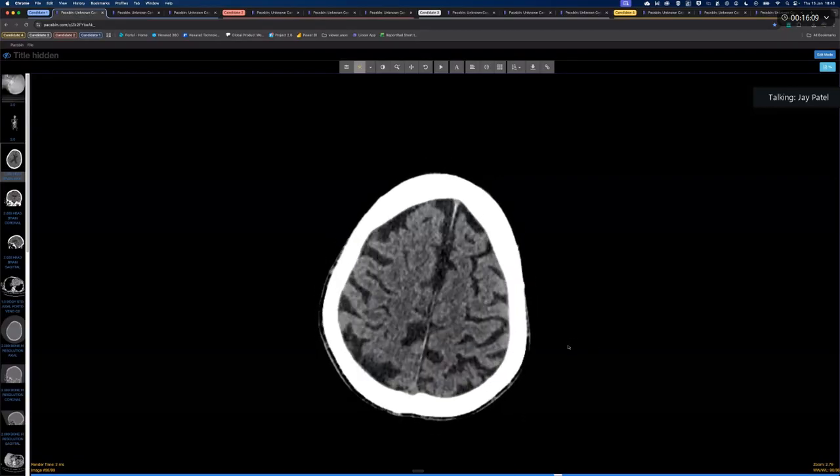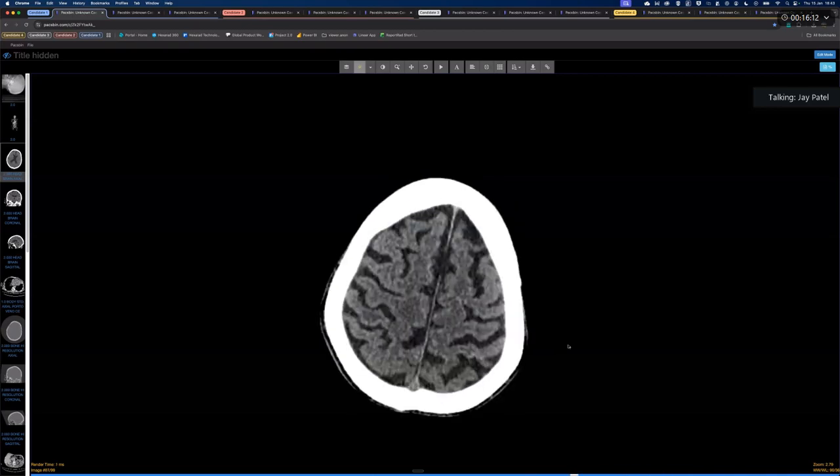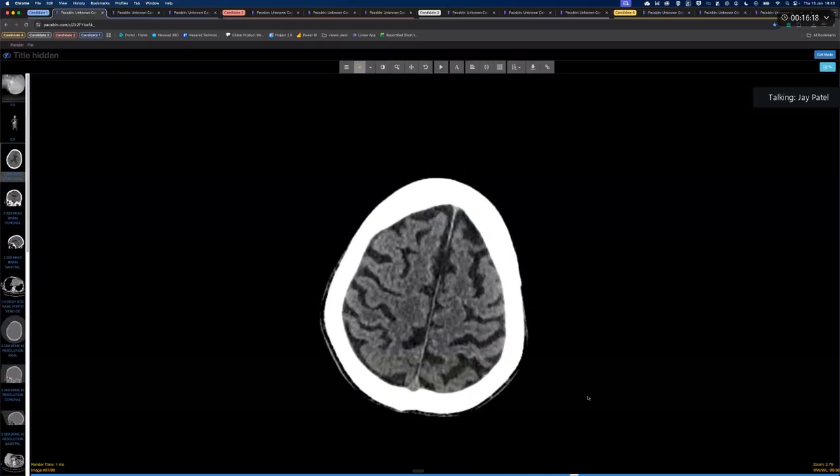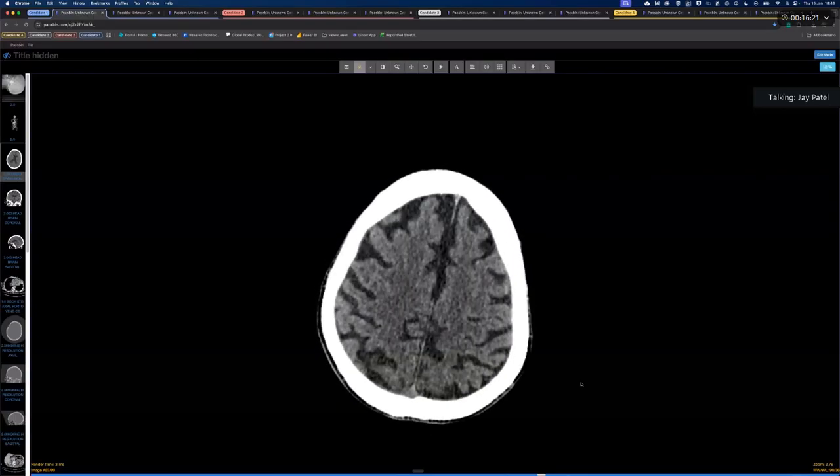The first thing I showed you was the CT brain, and I think you did very well in spotting these areas of mild hyperdensity. Just talk me through, and I think it's very difficult in this case, how do you determine the difference between a metastasis and an infarct regarding the edema? Okay, in cases of metastases, it will likely be multiple, involving supra- and infratentorial spaces and surrounded by edema, showing enhancement and solid components. The characteristic of that edema is what? It would be vasogenic.